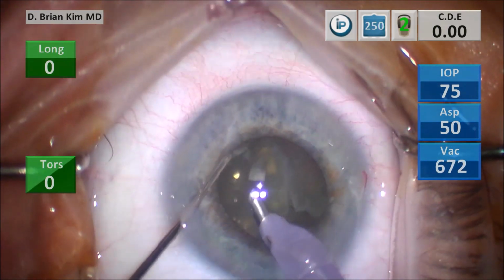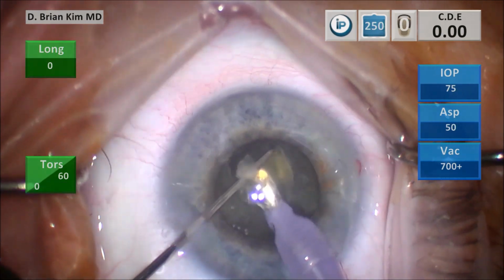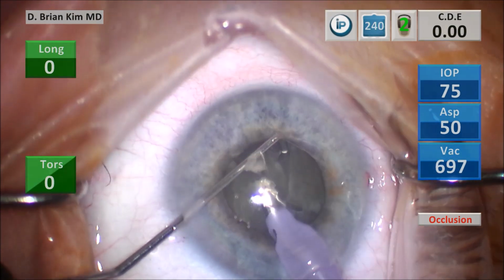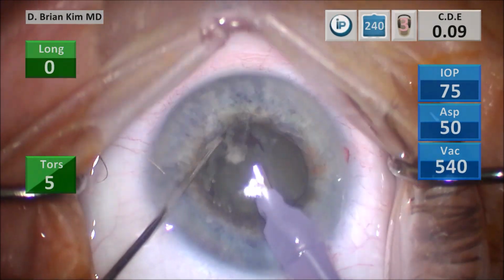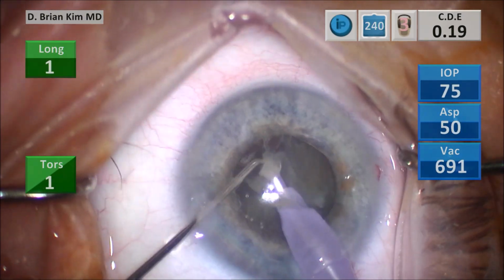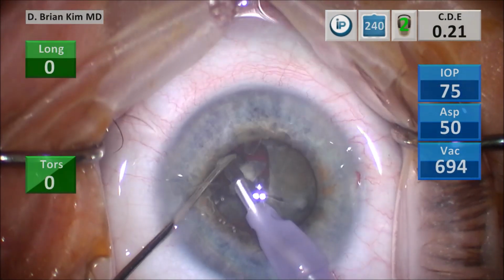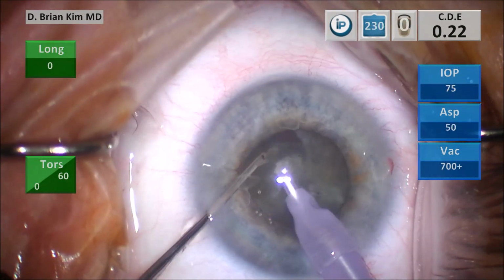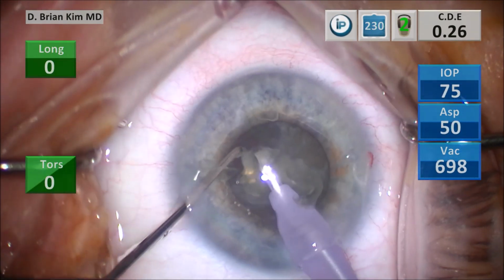I use high vacuum to pull that first quadrant up very carefully, and then I'm crushing the lens piece between the chopper and the phaco tip. I'm using the chopper to crush the lens piece against the phaco tip. I'm using predominantly high vacuum and a little bit of ultrasonic energy. I'm using some vacuum to grab that second piece of that first quadrant out of the bag. Whenever I crush the lens between the chopper and the phaco tip, I stop the vacuum and I crush it, and then I resume the vacuum.